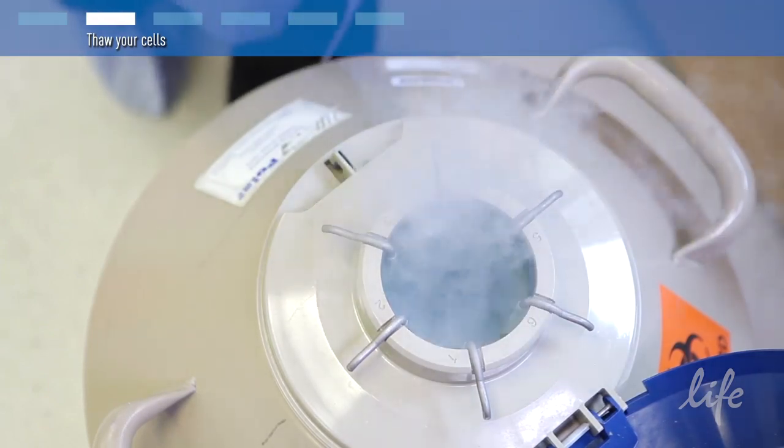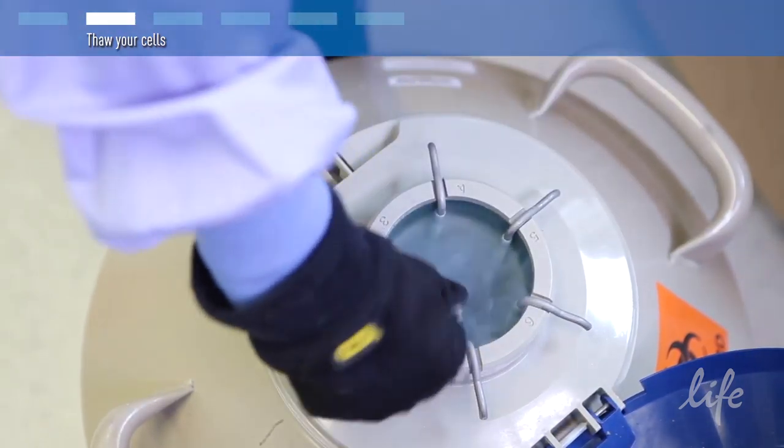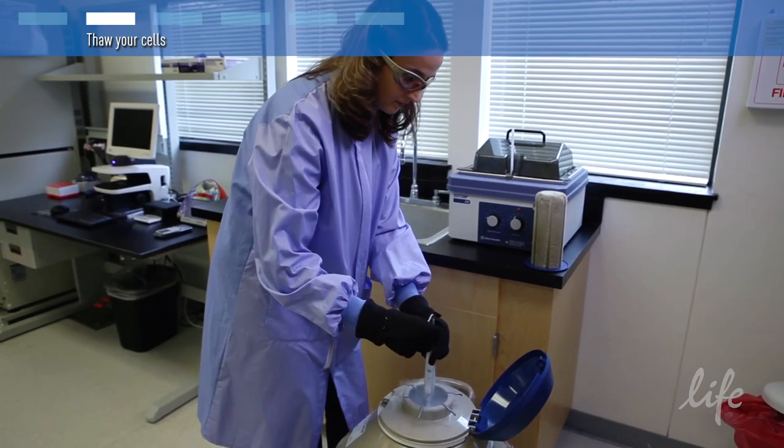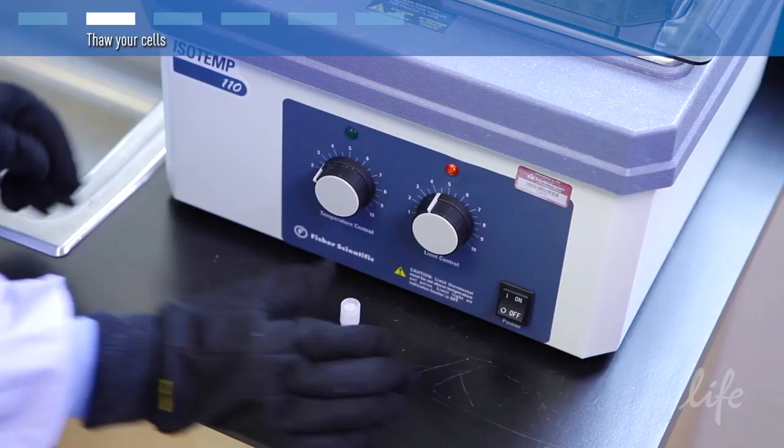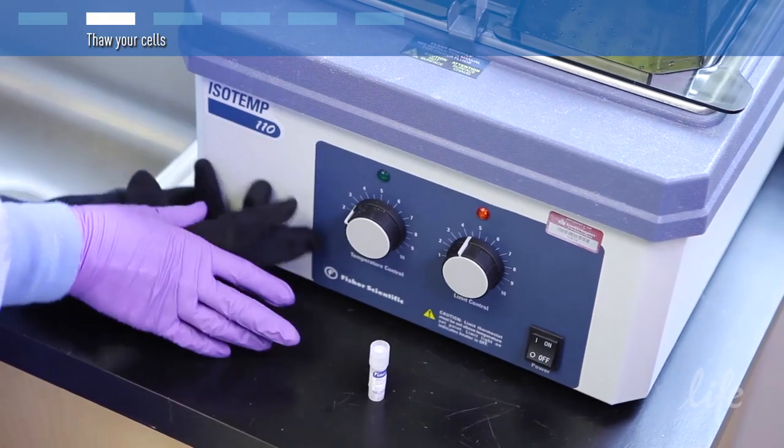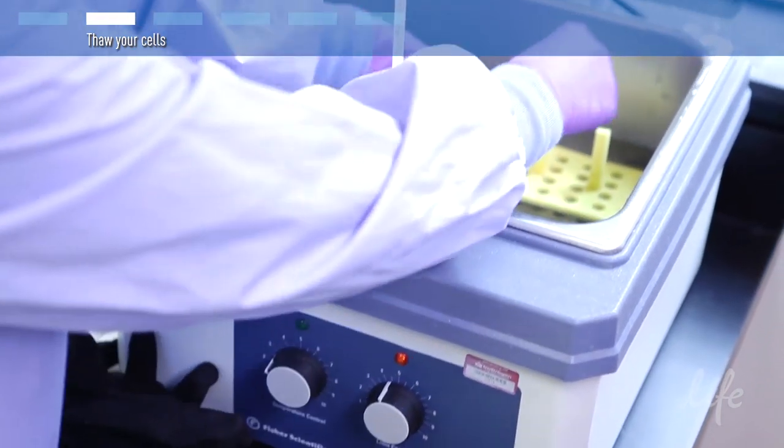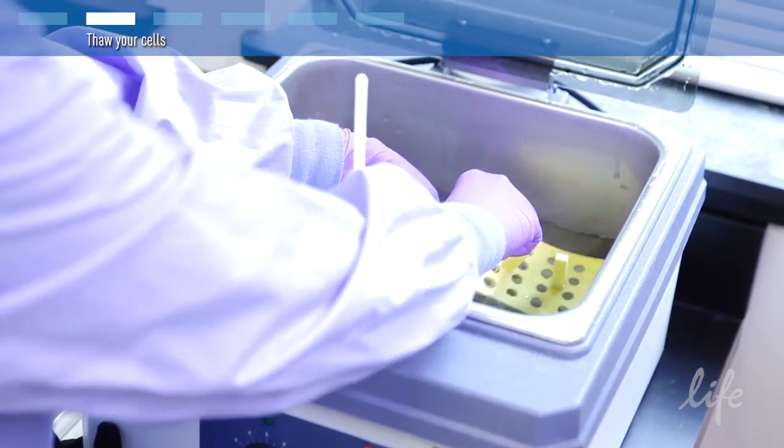Protect your hands and eyes when you pick up the cell vial from the storage tank. Promptly place the frozen cryovial into a 37°C water bath and submerge the lower half of the vial for about two to three minutes to thaw the cells.